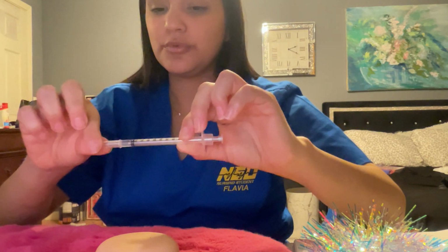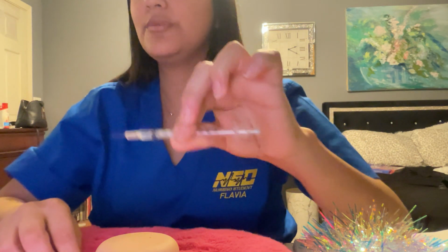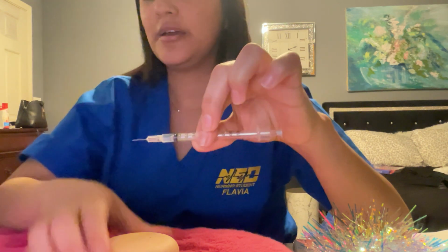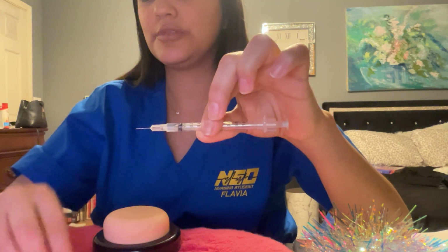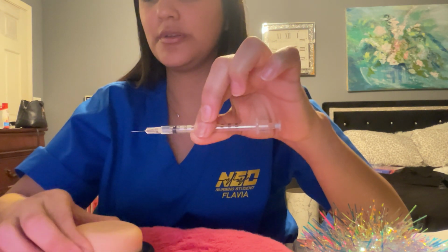Okay, so then you're going to pull it outwards, and you want to make sure you hold the syringe between the thumb and fingers of the dominant hand, grasping the dart.